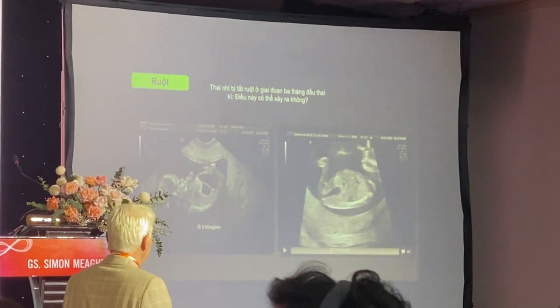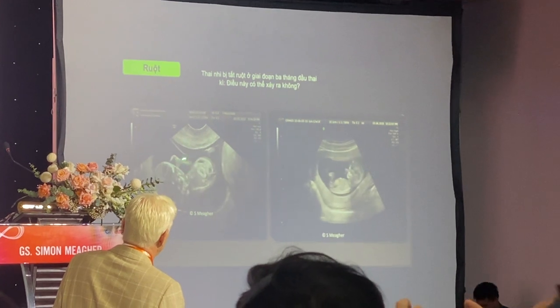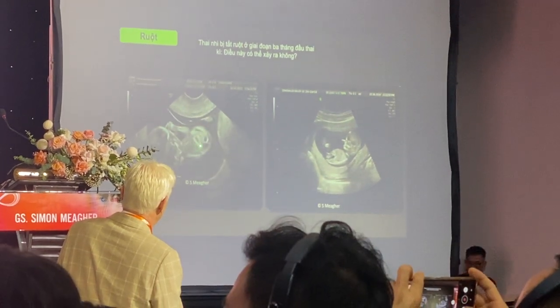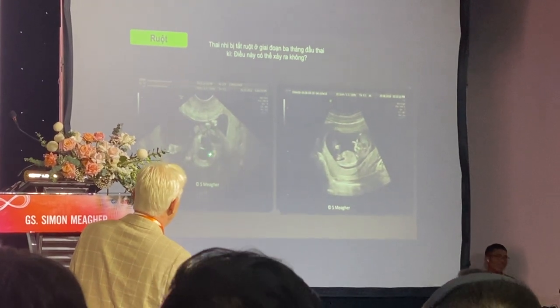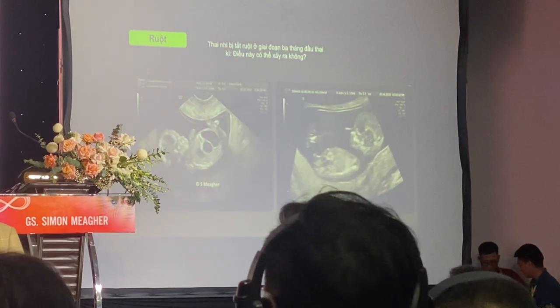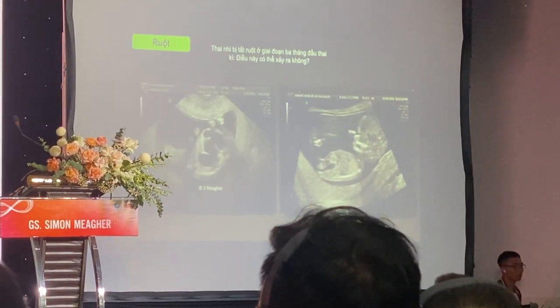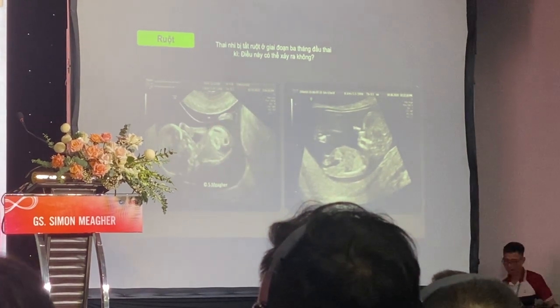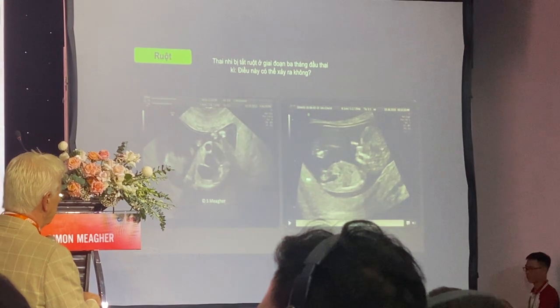The next system is the gut. So in the gastrointestinal tract, you can see bowel dilatation in the small bowel of this baby. Increased bowel echo texture, dilated loops of bowel, increased peristalsis. All three things that we rely on at 18 to 20 weeks are present in the first trimester of pregnancy. It's a certain diagnosis. In this case, it's anorectal atresia, so it's the large bowel.